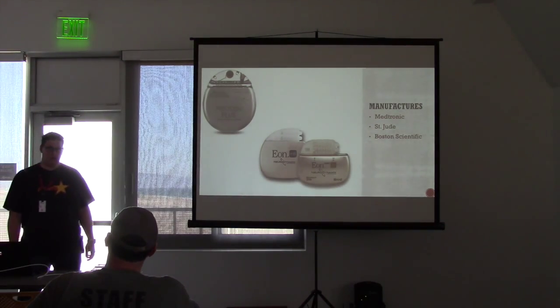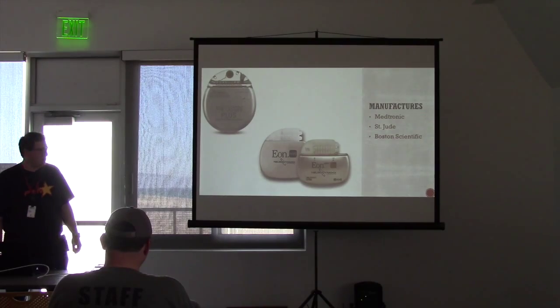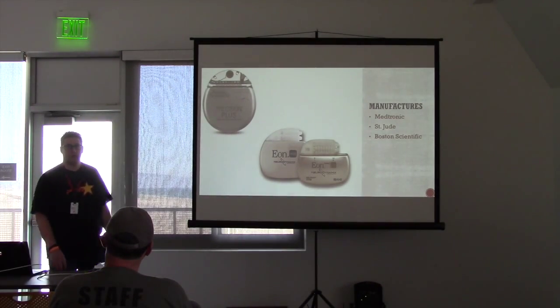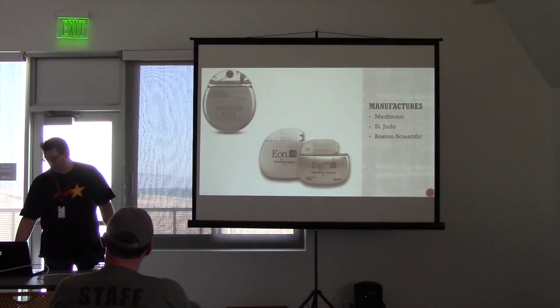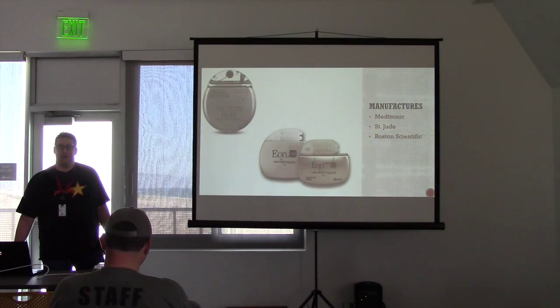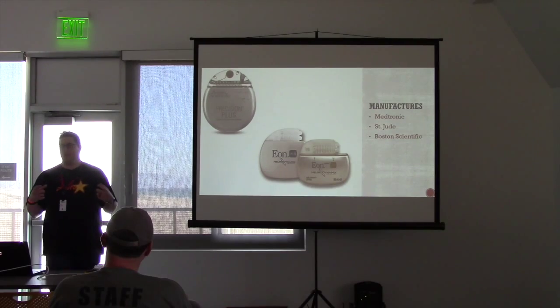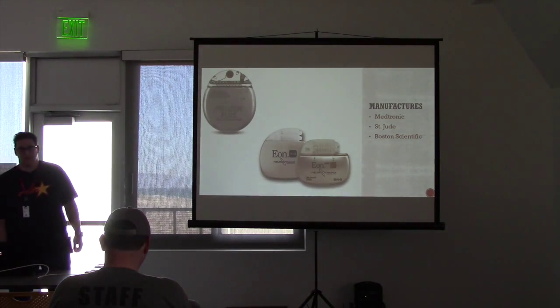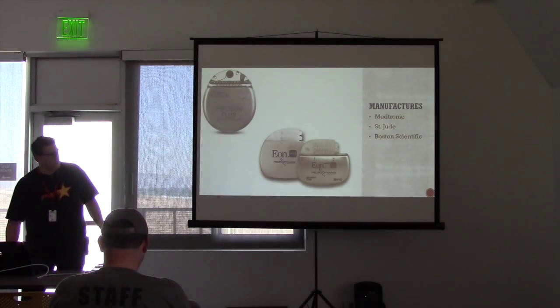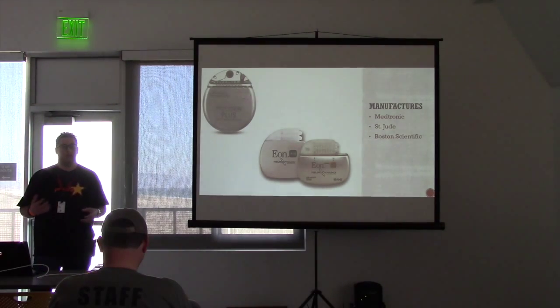This is a surgery to install and uninstall these devices. They recalled the battery because the battery would leak into the body. So when you have to send out 10,000 notices of a recall to people who are just now finding out that they need surgery to pull that out, and unfortunately they send out messages like any recall for your car. You get a letter in the mail saying, by the way, you need major surgery again because we screwed up on this product. Did they pay for that surgery? If you look online, you'll see lawsuits and that kind of stuff. But if you think about it from this point, this is no longer just updating firmware.